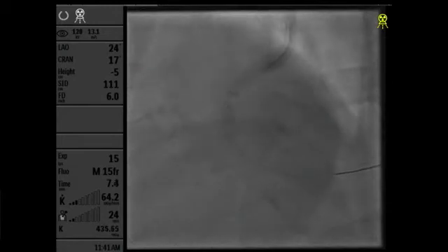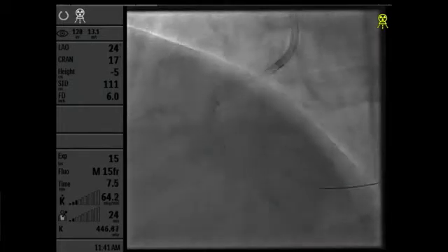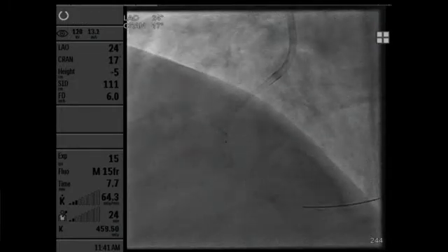Yeah, sometimes it is rough. We're at 2, 4. My question to the panel is, how good is this technique of just using a 2025 balloon to ensure that you have good dilatation of the lesion? Because I can tell you for a fact that we've been burned so many times using this technique and saying, oh yeah, the stent's going to open up. And then you put the stent in and you see a nodule basically banging on your stent. So it makes me wonder about this technique of using a 2025 balloon and saying, hey, it opened up very nicely. We should be able to deliver the stent.